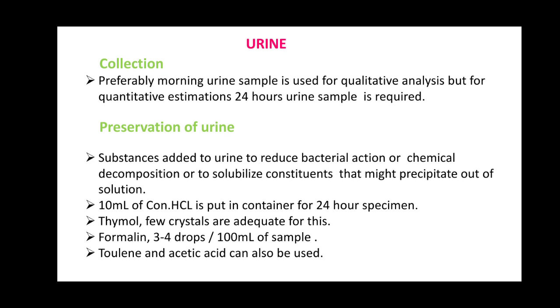So next to the blood, urine is the most common specimen. The collection will preferably be morning urine. The sample is used for qualitative analysis, but for quantitative estimation, a 24-hour urine sample is required. And the preservation of urine is very important.